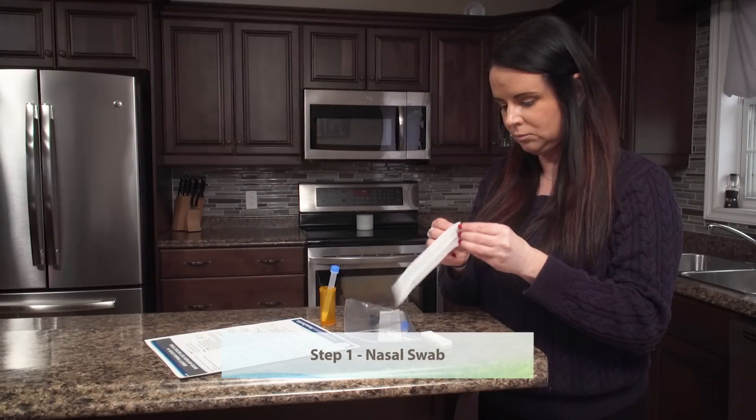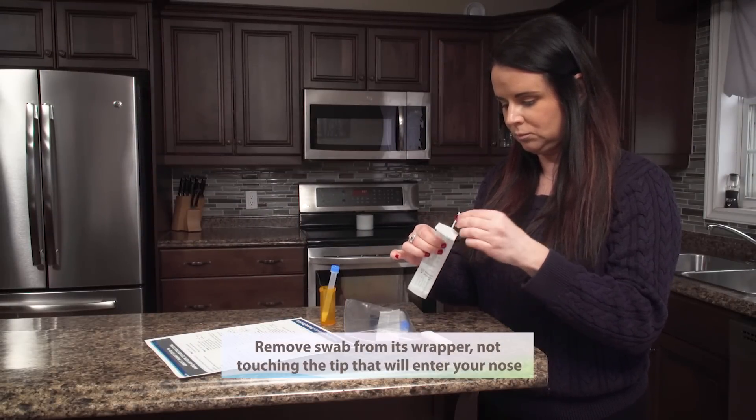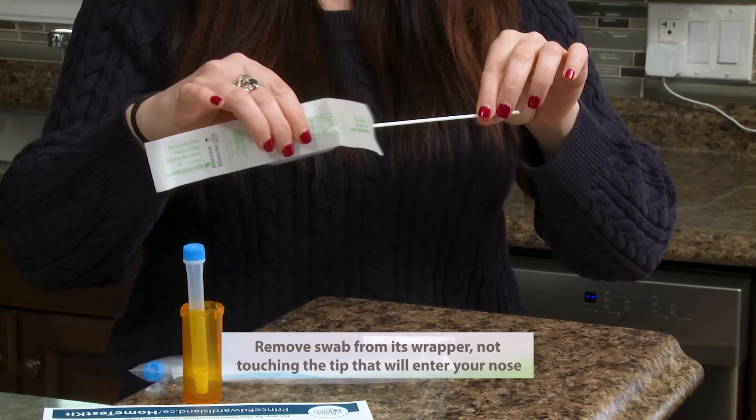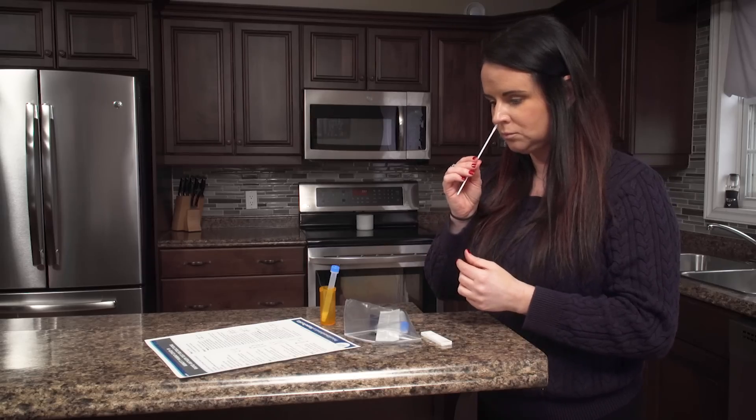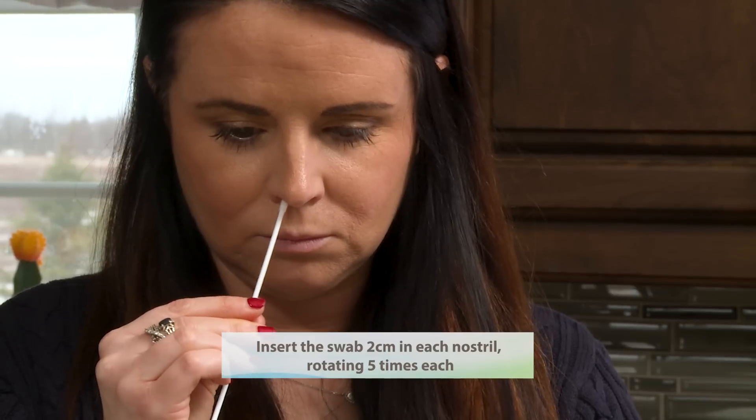Step one: nasal swab. Remove swab from its wrapper, taking care to avoid touching the tip that will enter your nose. Insert the swab two centimeters in each nostril, rotating five times each.